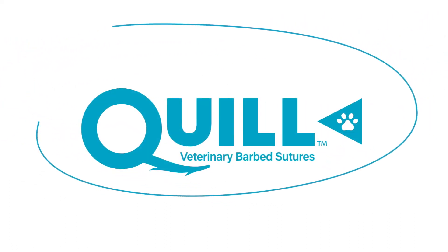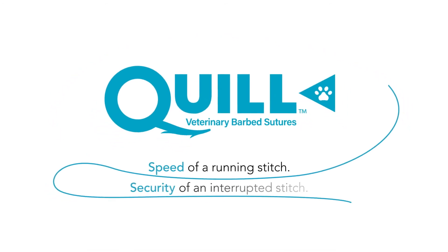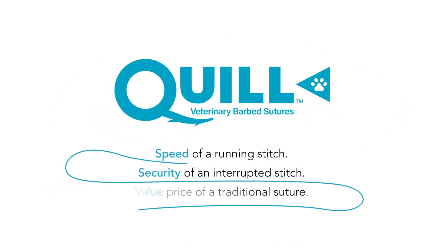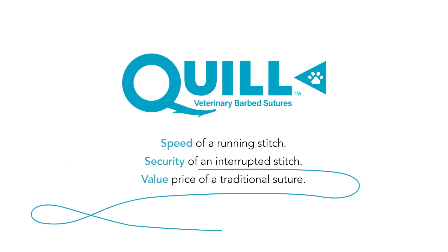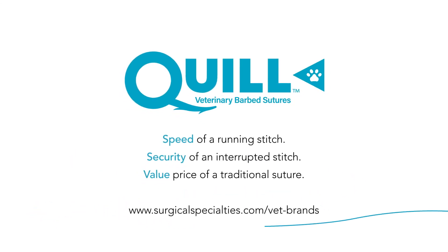Go knotless with Quill Veterinary Barb Suture. Speed of a running stitch. Security of an interrupted stitch. Value price of a traditional suture. Learn more at surgicalspecialties.com/vet-brands.